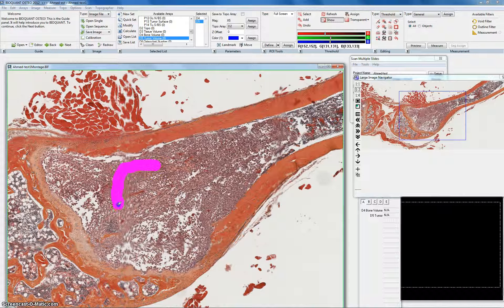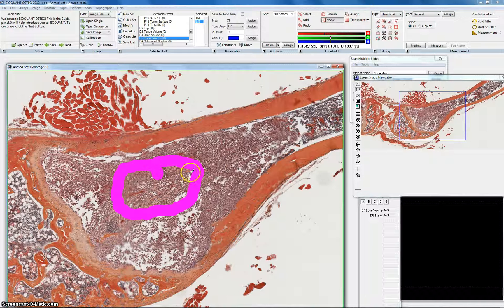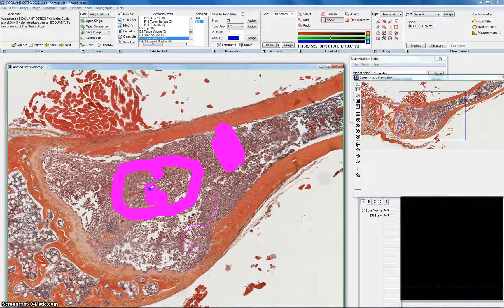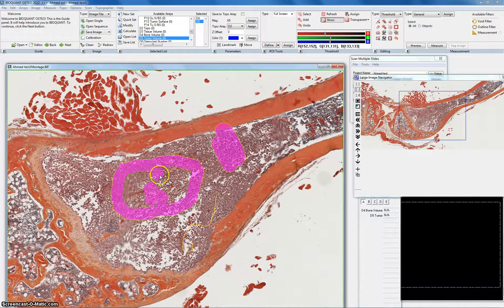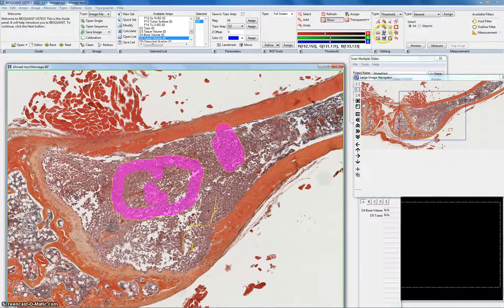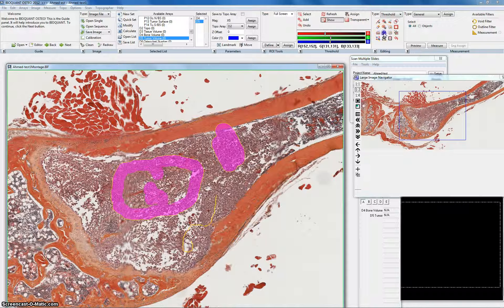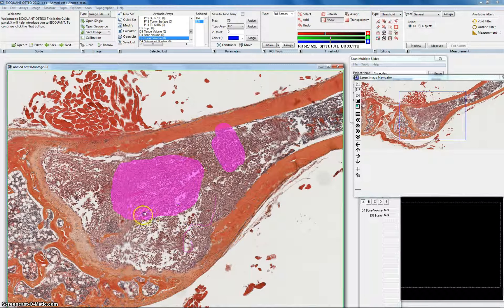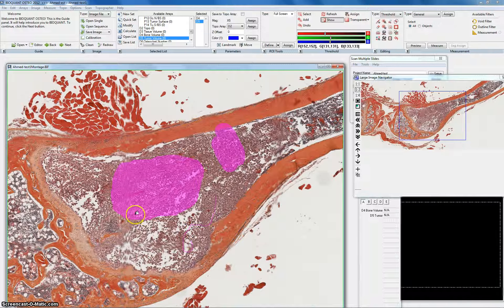Now I'm tracing this part. Using the scroll you could make the circle bigger like this big or you could scroll down to make it very fine like a fine pen. It's up to you. And then you don't have to keep filling it. You could just go to this bucket here and touch it. As long as it's a closed circuit or a closed circle it will be filled. If it's not a closed shape it will never be filled.